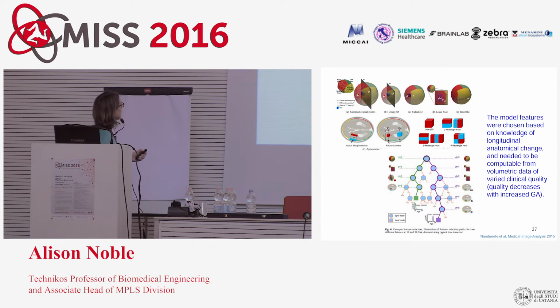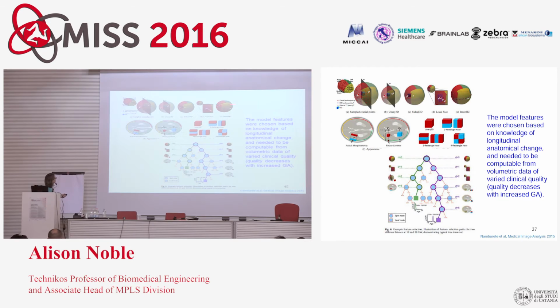As for how she was building the solution, she was using some of the classic features you'd expect, all implemented in 3D. You have to know where you are in the coordinate system of a brain, so she had a method that allowed you to put that coordinate system on the brain.